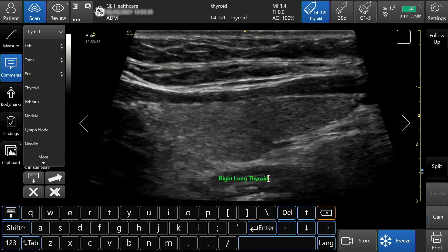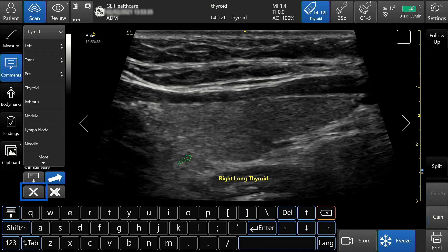You can also add an arrow by selecting the arrow tab. You can tap and drag along the screen. You can delete the arrow or the last comment by selecting the single X. If you want to clear the entire screen, select the double X icon.